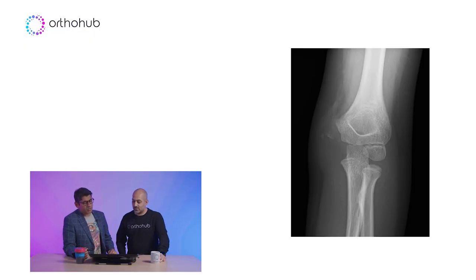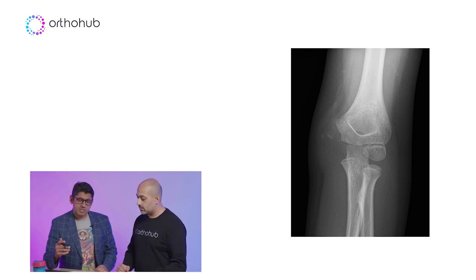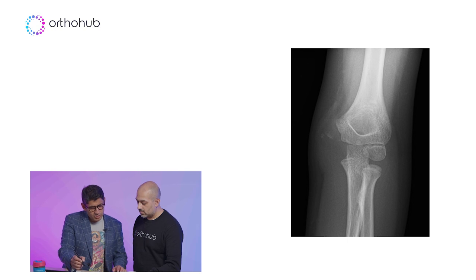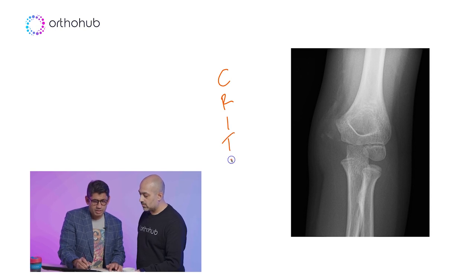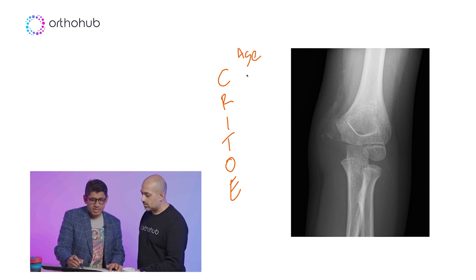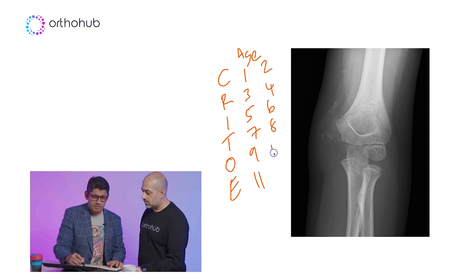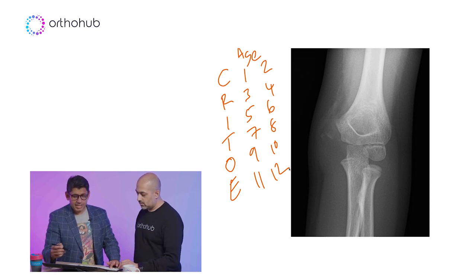So this is an AP radiograph of the elbow, and these can be more complicated than people give them credit for. The first thing you want to know is the age of the child, because you're going to look for the capitellum, the radial head, the internal epicondyle, the trochlear, the olecranon, and the external epicondyle. Then you look at their age - depending which books you read, it could be 1, 3, 5, 7, 9 and 11, or 2, 4, 6, 8, 10 and 12. So once you know the age of the child, you know what you're looking for and you can actually age the child themselves.